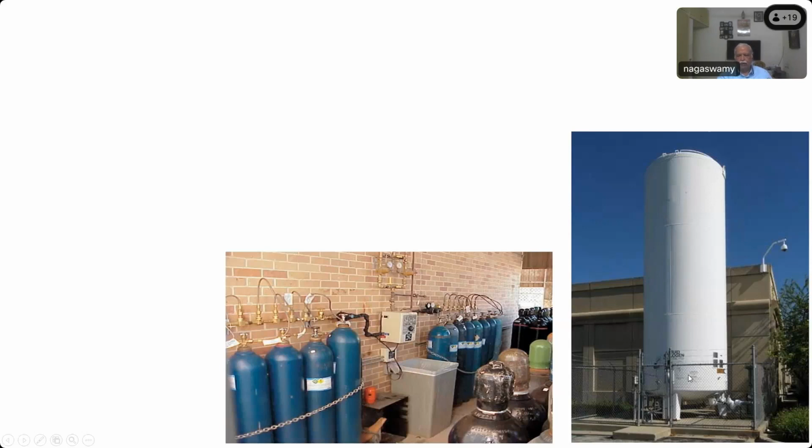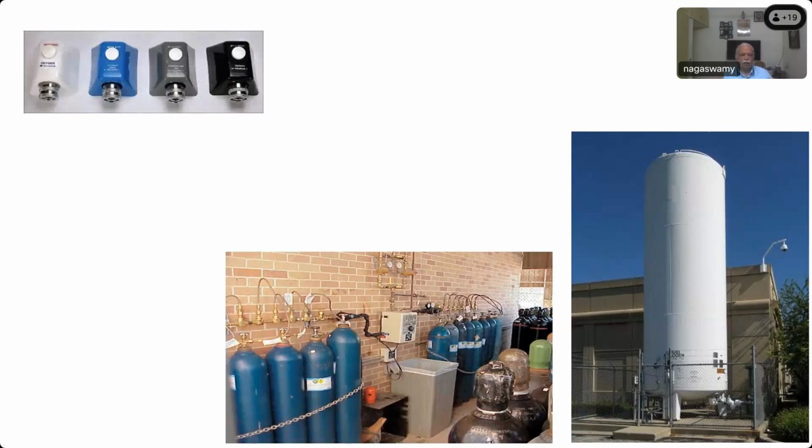There is a heating element here, with so many connections you see, and that will allow the liquid to come here and get heated up, turning the liquid into a gas. Then there will be multiple pressure regulators to check the pressure and deliver it at whatever pressure you want. All these attachments are there. So that is the basic thing that you should know.